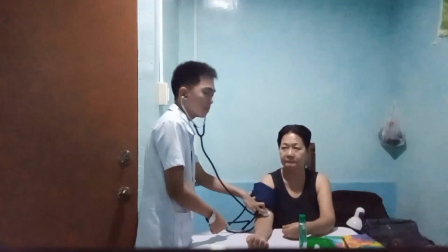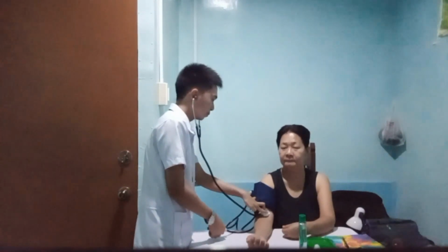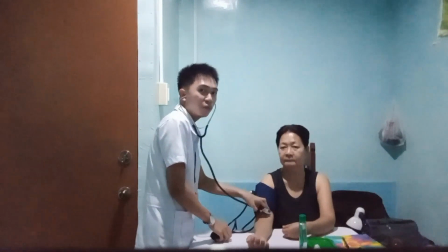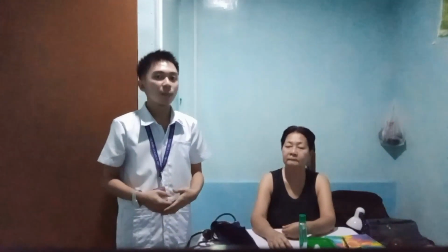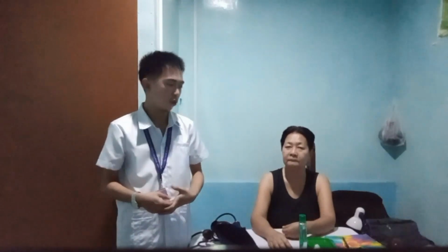So just relax because I'm going to repeat the procedure again. Now remove the cuff and disinfect. The last thing is to summarize the findings obtained during the working phase. Provide the client the opportunity to ask or raise concerns, and don't forget to thank the client for the time and cooperation and perform hand washing. And don't forget to document the result of the blood pressure.